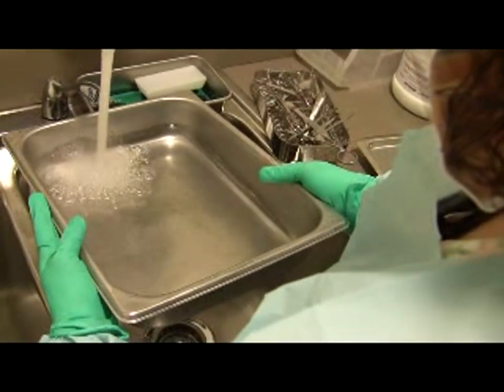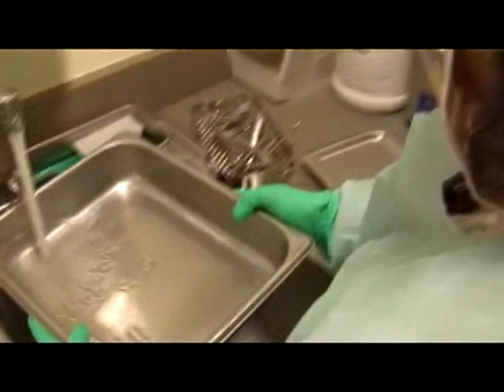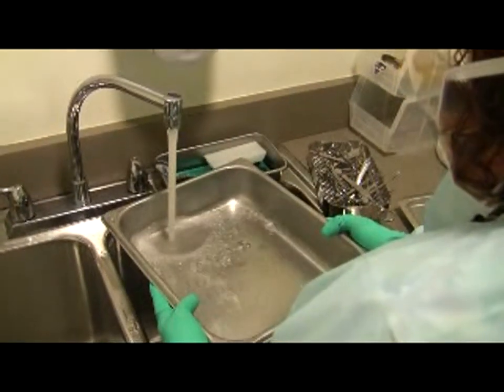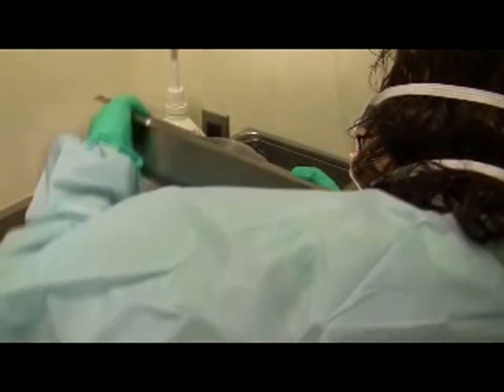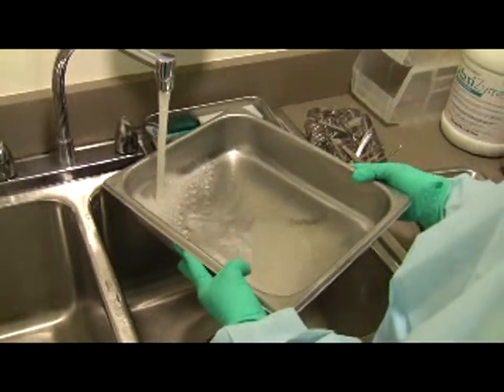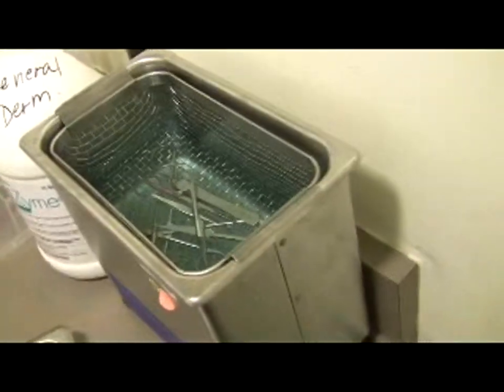Rinse out the Maxizyme tray and use it to carefully pour water into the ultrasonic cleaner — you'll need a few trays-worth. The water should be covering the instruments and have the blue hue from the Maxizyme. Add one pump of Maxizyme detergent to the ultrasonic cleaner water.